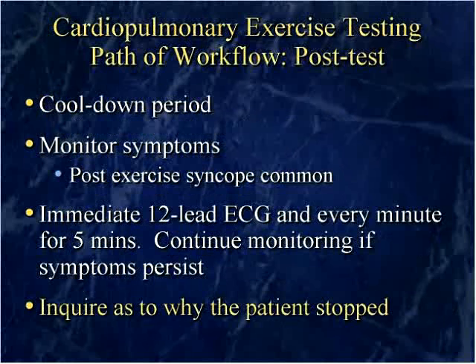Okay, why did you stop exercise? Was it because of breathing? Was it because of legs? Was it a combination of both? Because there's a big difference in between, I think it was my breathing, but could have been my legs, versus got tired, had to quit. So there's a big difference in between the amount of effort that a subject is getting, and sometimes that's important information to pass on.